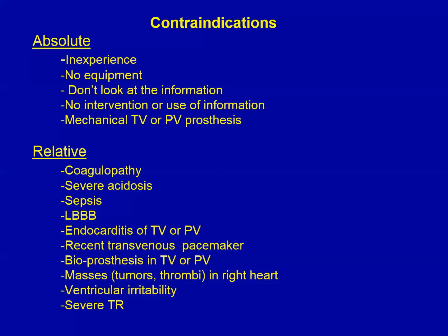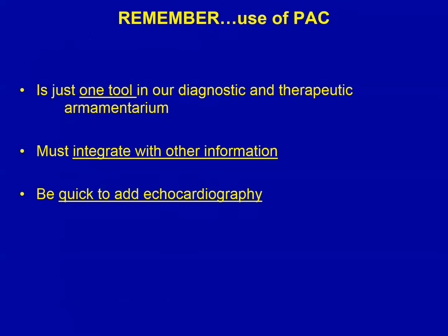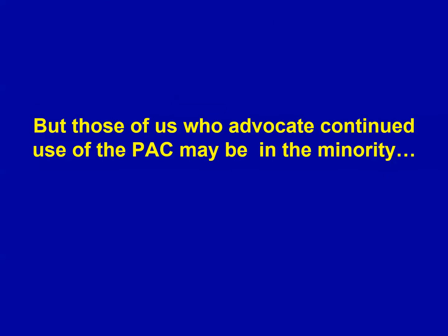On this slide, I've listed some of the absolute indications, contraindications, and some relative contraindications which have been mentioned by others. Finally, the pulmonary artery catheter is just one tool in our diagnostic and therapeutic armamentarium. One must integrate the information provided with all other data and be quick to add echocardiography.